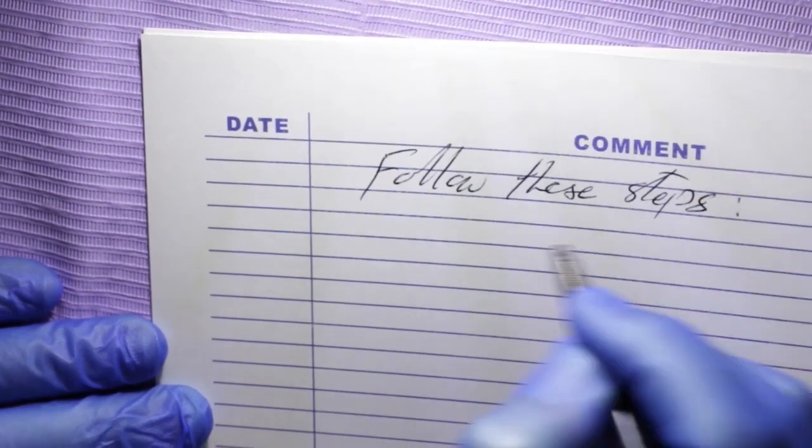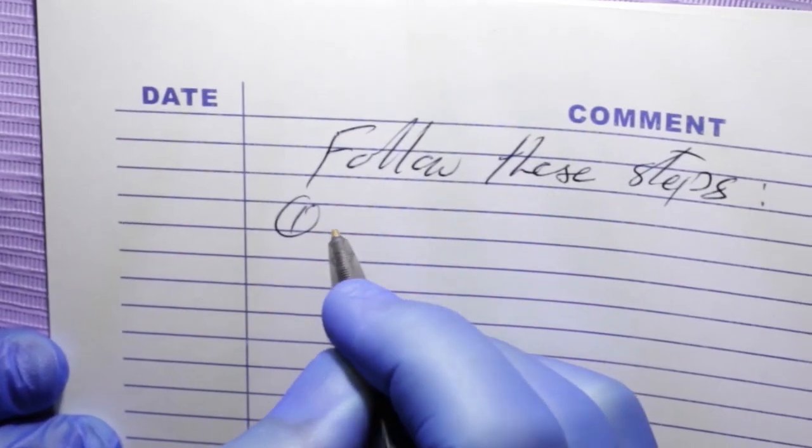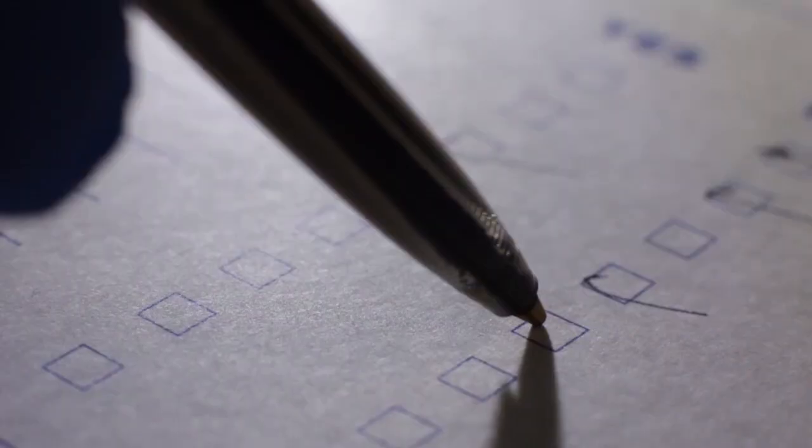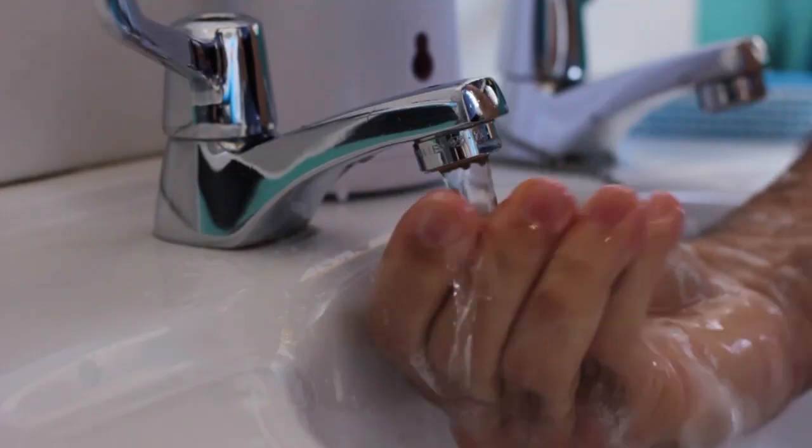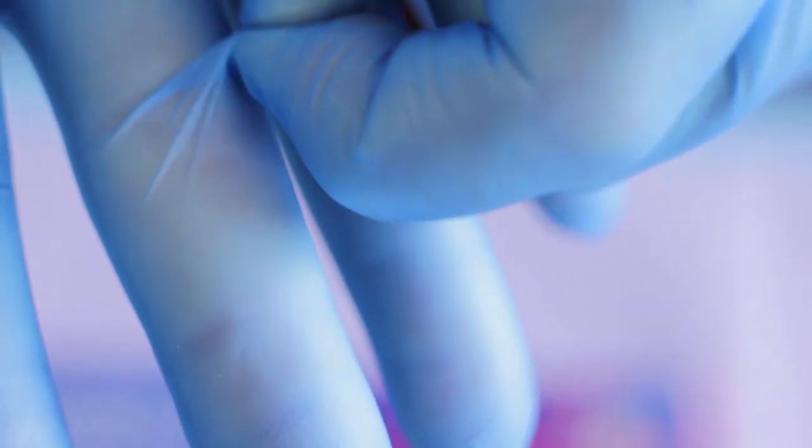Method 1. Follow these steps. Remember the basics: take a medical history, prepare your hands hygienically, and don clean gloves.